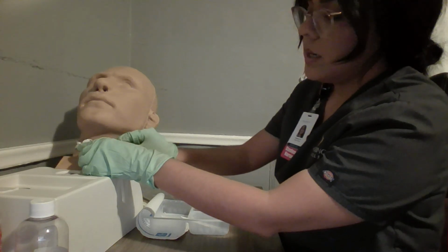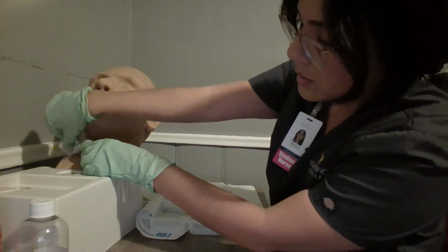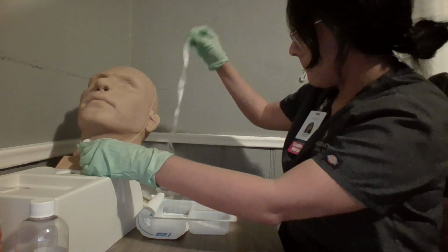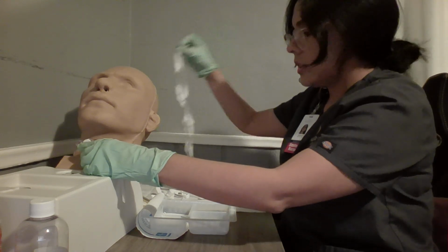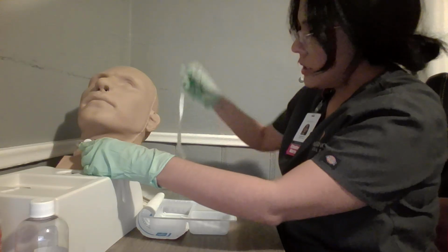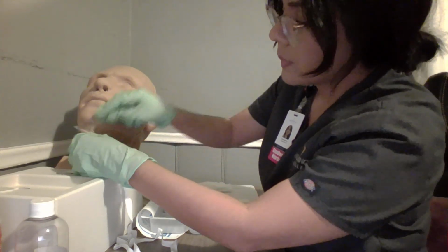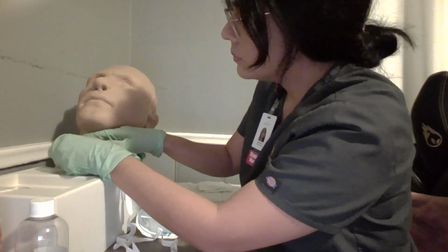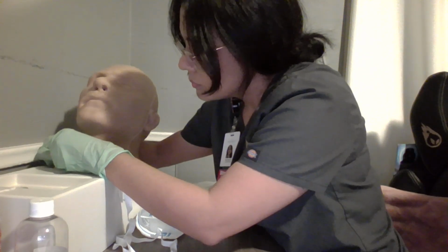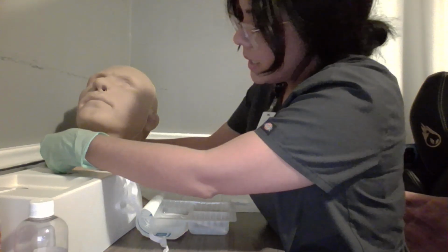At this point, I would ask another nurse or an NAP to hold the tube as I change the ties. I will discard this and I will change the ties using the one or two strip tie method. So I have grabbed a new tie here.